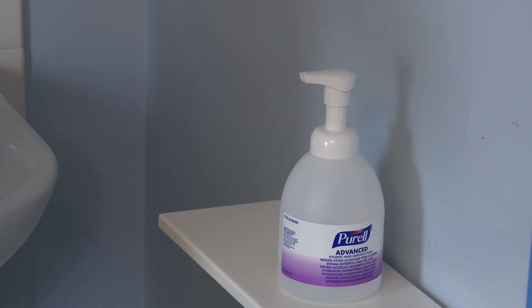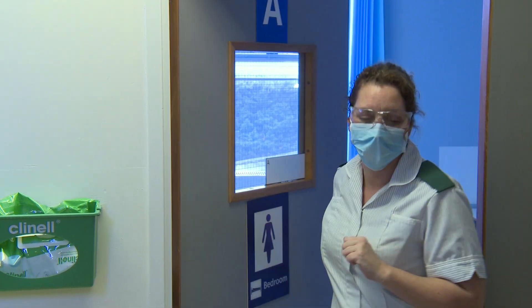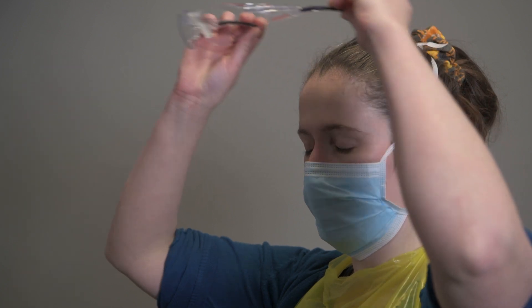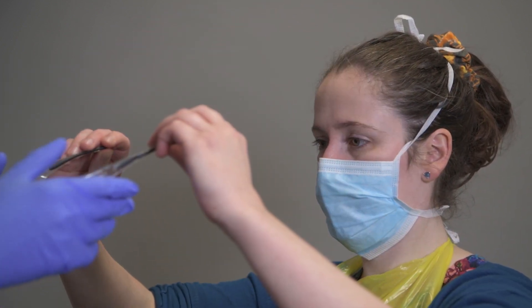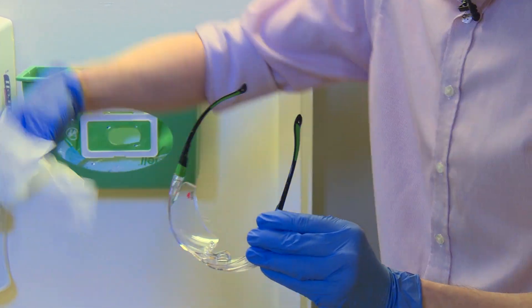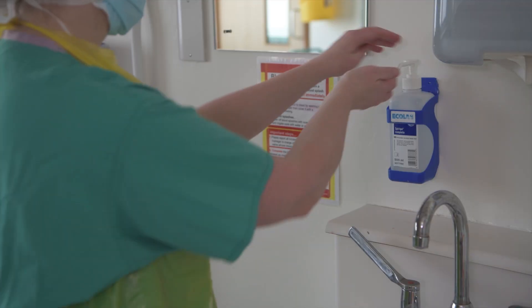Alcohol gel hands before and after exiting the room. To remove goggles or face shield, use both hands to handle the elastic straps or arms of goggles by pulling upwards then over the head. Close your eyes as you pull. Outside of goggles or face shield are contaminated and should not be touched.